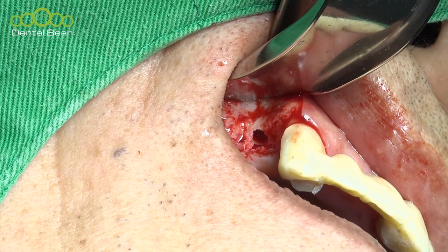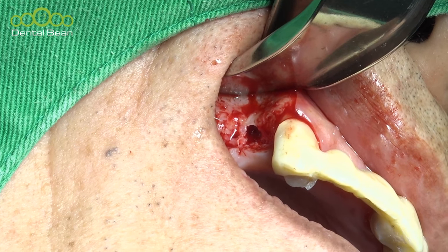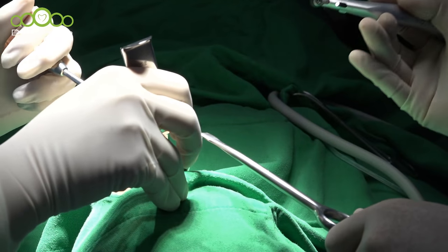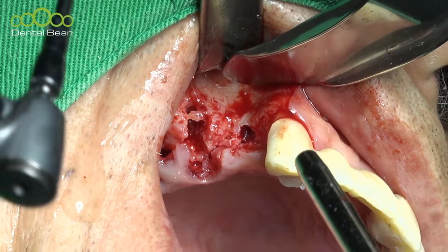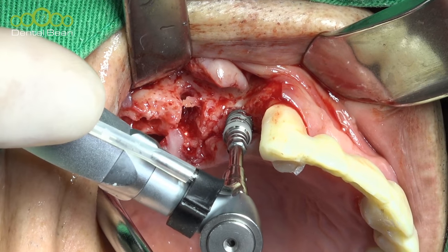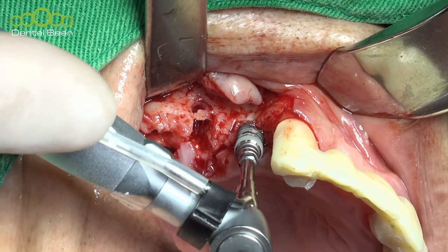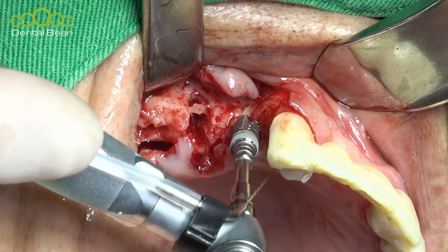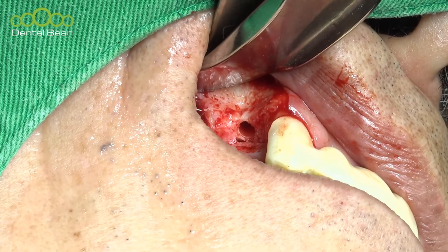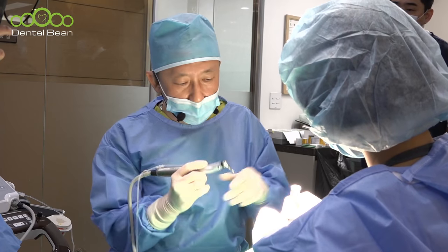The bone is a little bit relatively hard. Reverse mode for a moment. It requires additional drilling at the time. Just take out here. And then I will try the 4.0 drill. 4.0.